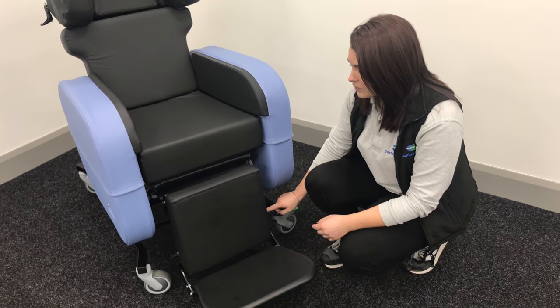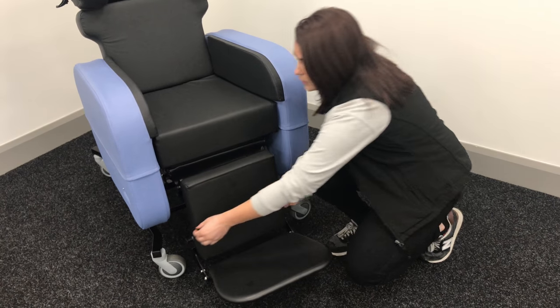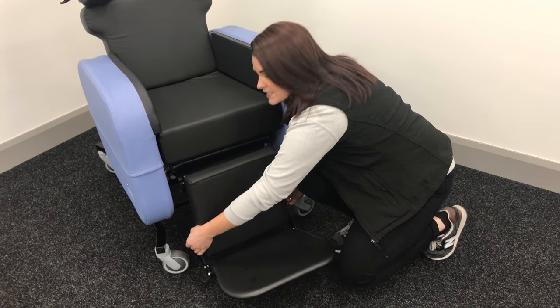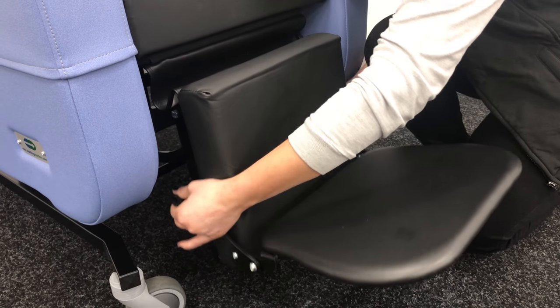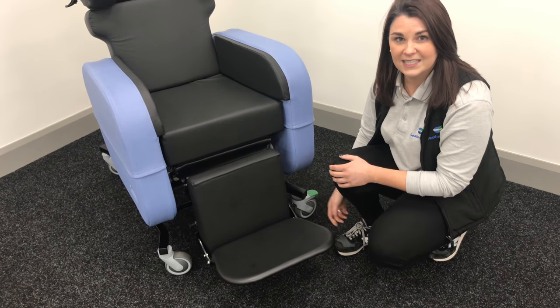You'll see that there are two plungers, one on each side of the leg rest. So you just pull those out simultaneously, get the height that you need, and let those plungers pop back in again. Again, really simple and easy to do.